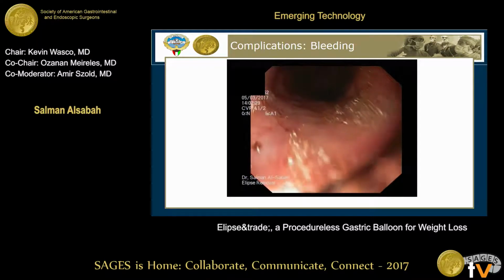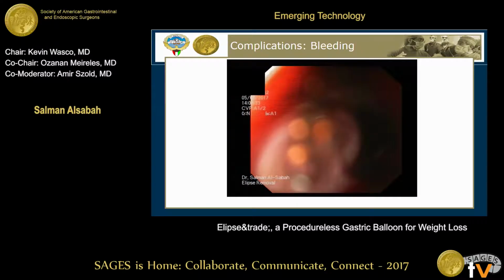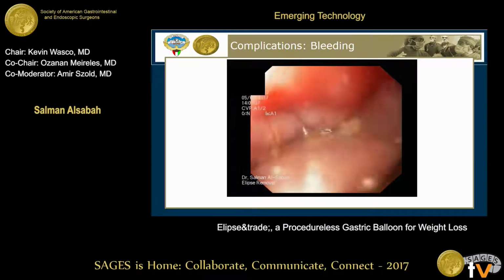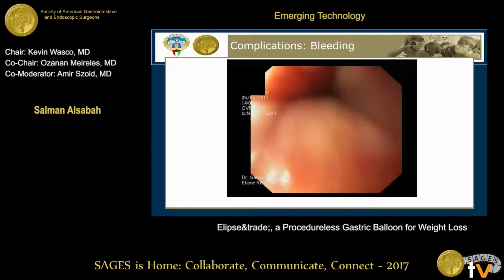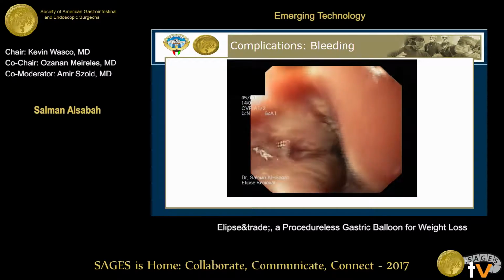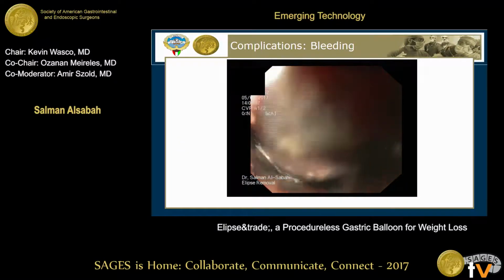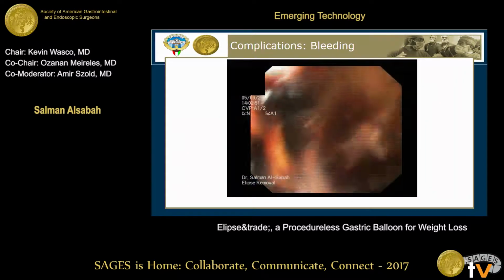And the other thing I want to tell you about, which is very important, is that you have to take a good history. This patient was on blood thinning medication because of a history of DVT. 3 days after the balloon insertion, he presented to us with an upper GI bleed. So we had to do an endoscopy. As you can see, there are multiple ulcers and a Mallory-Weiss-like tear with bleeding. So this required an urgent removal.